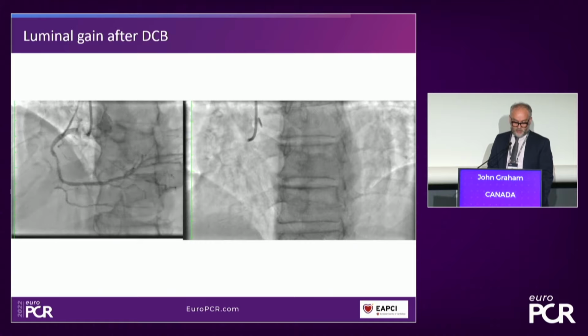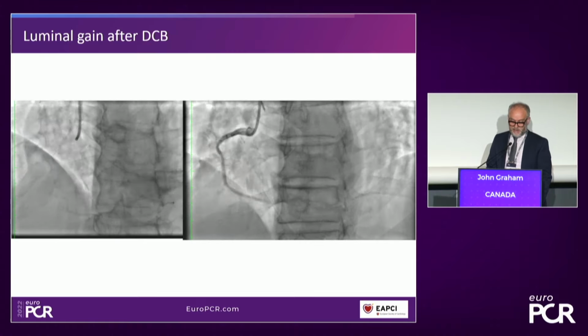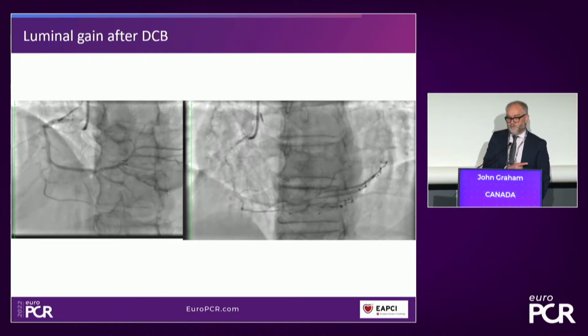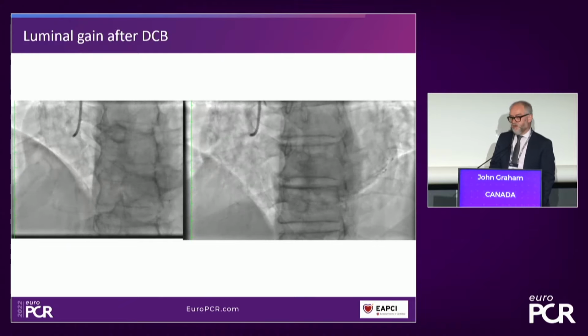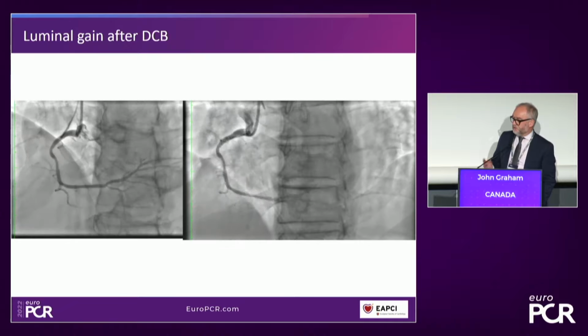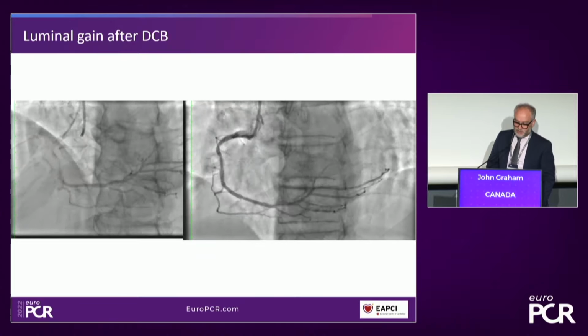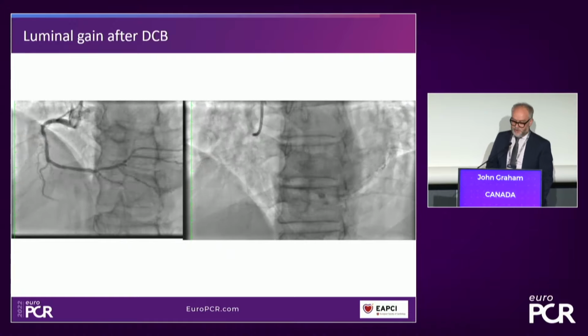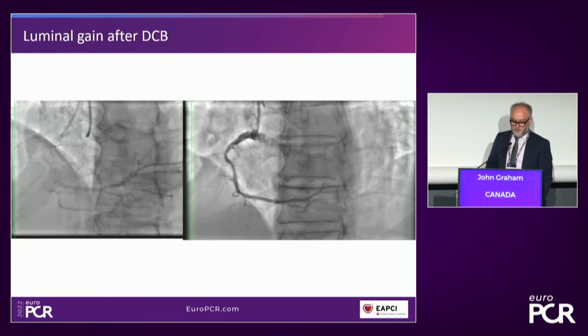This is the angiogram that was taken at that time. And in the interest of time, I actually went back and looked at his angiogram from 10 years ago, and the distal right coronary is very similar to what it looked like 10 years ago. So we reassured him, and he is now back on his bicycle, and his chest pain has gone away, and he is doing very well.